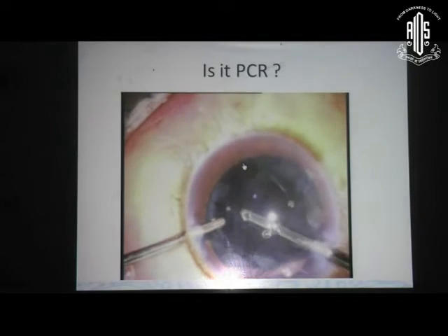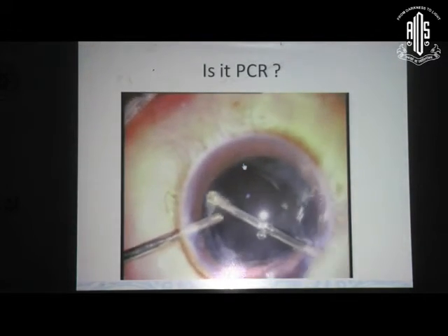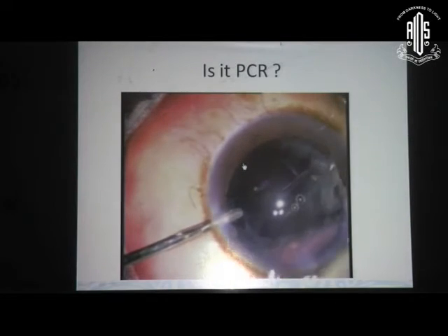Now this is what I say, that you believe what you see. If you have an excellent microscope and excellent recording, you will be much more confident in your surgery.